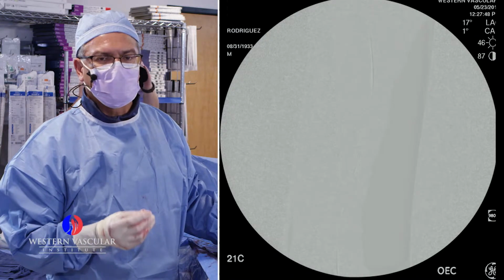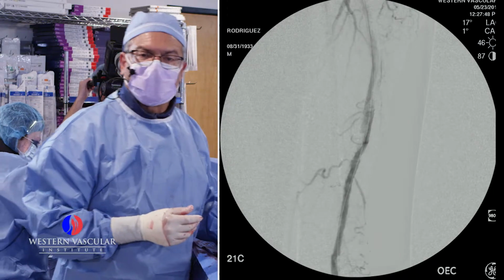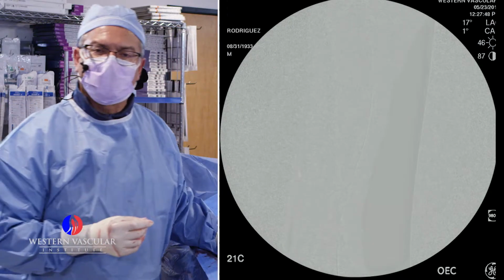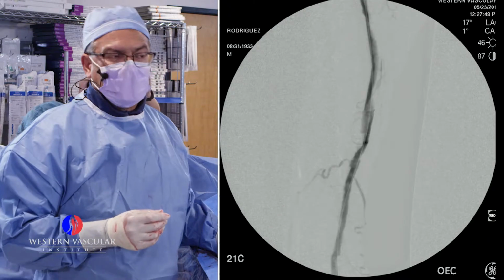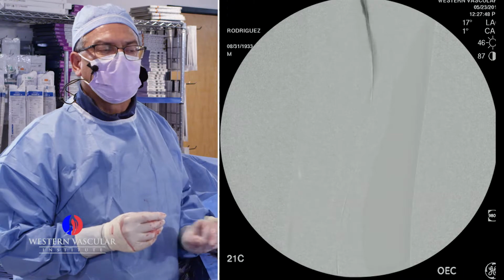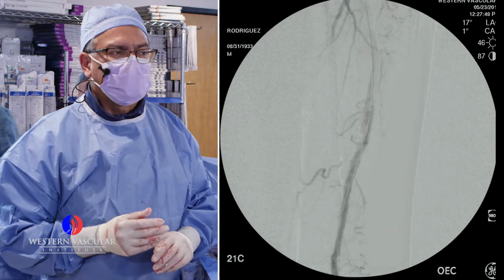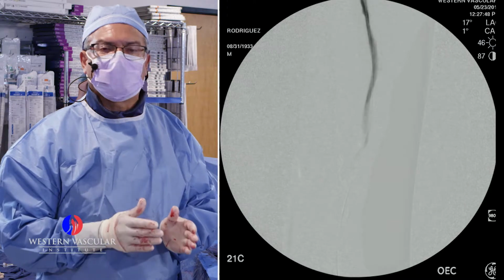You have to do something else. Occasionally we use the laser, or we use devices like an atherectomy device. Those are kind of cutting devices. But the problem with this case is that in some areas we are very close to the wall of the artery, and in some areas we are in the middle of the core of the plaque.